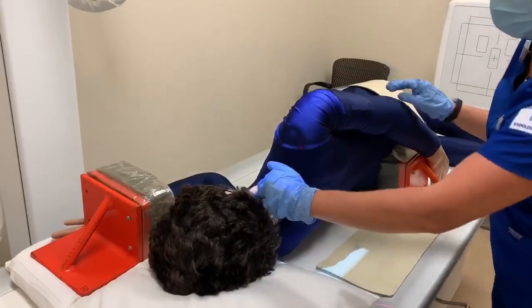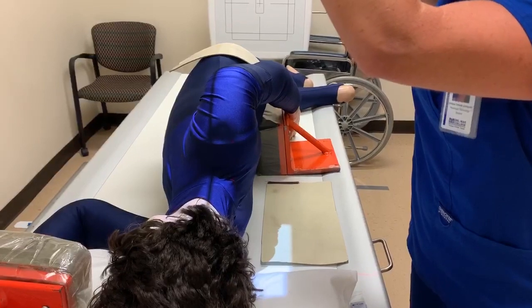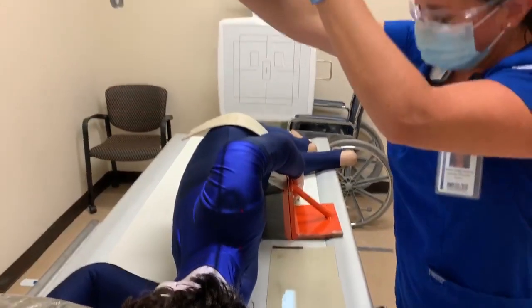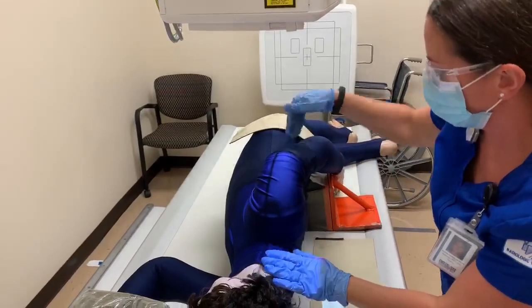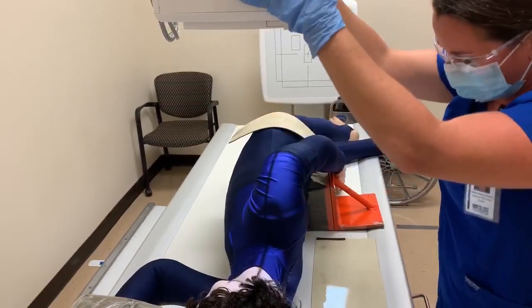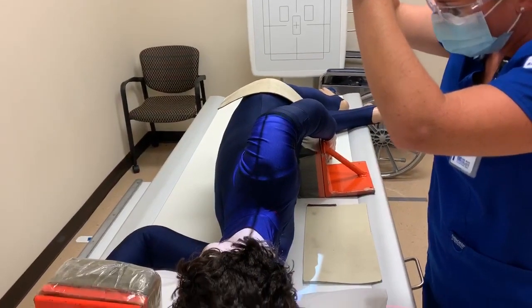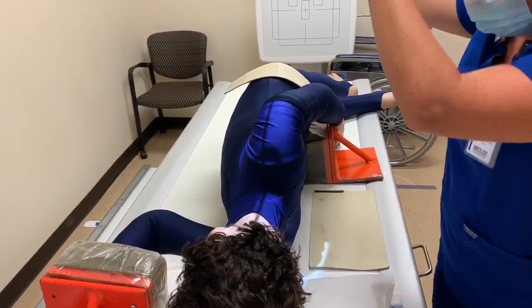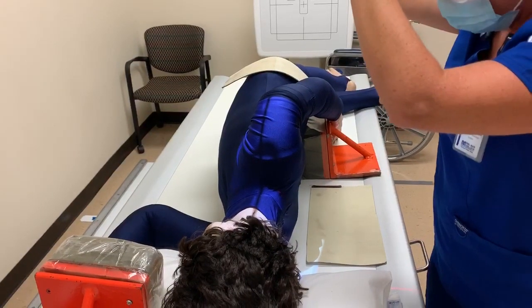You also want to check that you're aligned to the patient's spine. Sometimes turning this, which is kind of stiff, if you turn it, it follows the natural curve of your patient, so you can't turn your tube head. And don't forget to collimate.